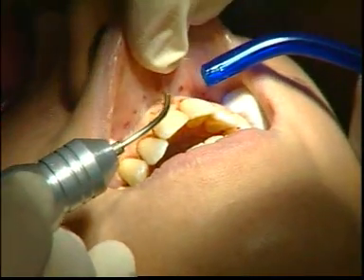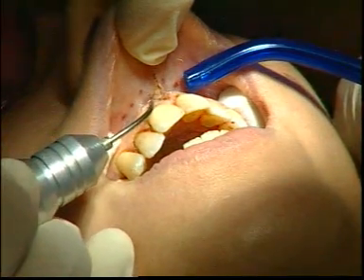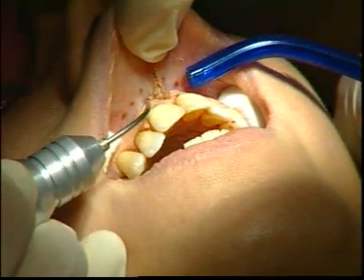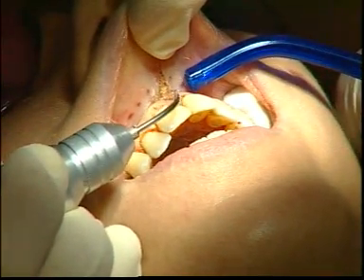Steady tension on the upper lip with the left hand allows the harder collagenous structures to be felt directly with the laser fibre. This produces adequate coagulation with sterilisation of the wound surfaces.